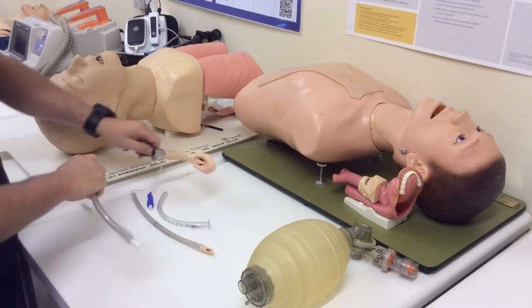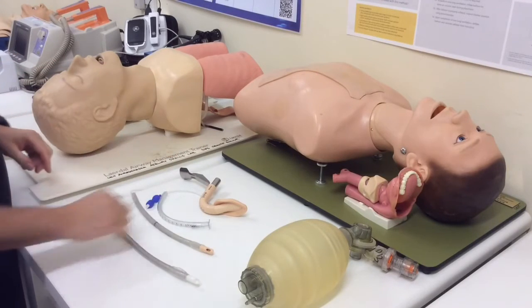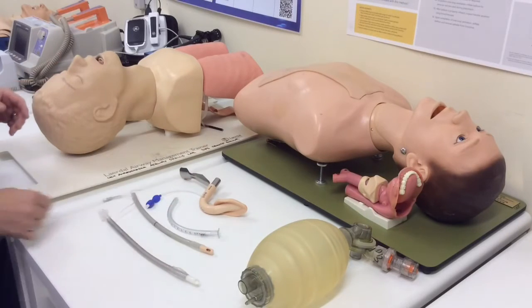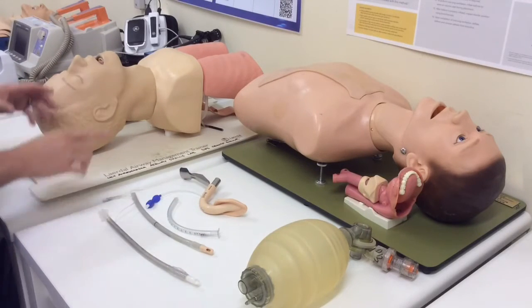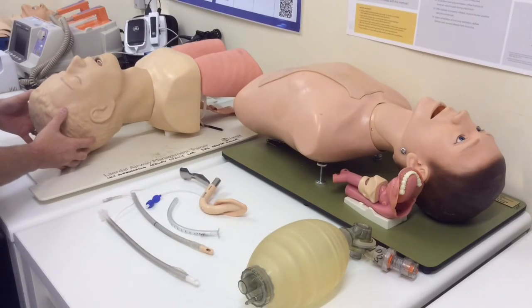So, how do we use this kit? You're going to need the appropriately sized Fastrach with its endotracheal tube, and then there's a push rod for removing the supraglottic airway portion, and of course you're going to have a method of ventilating your patient. The sizes are 3, 4, and 5, and they're sized according to ideal body weight as with the other supraglottics.